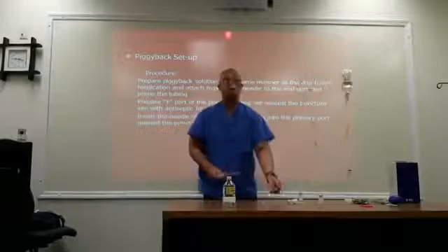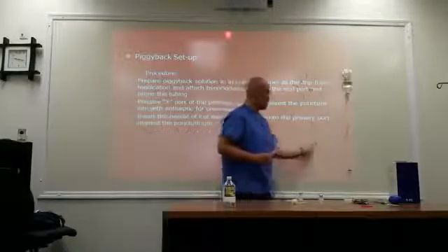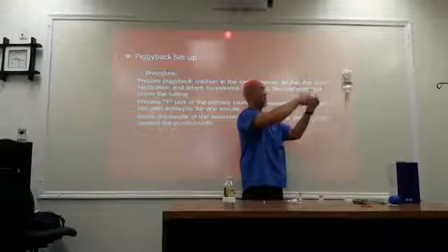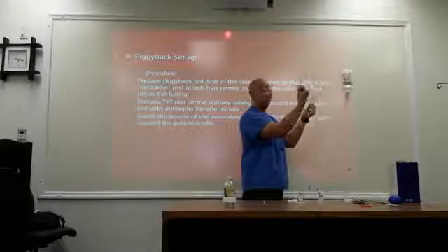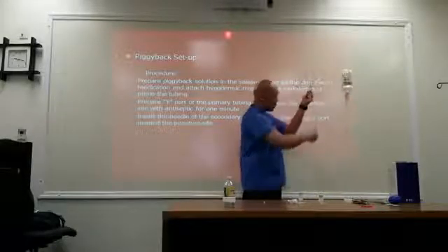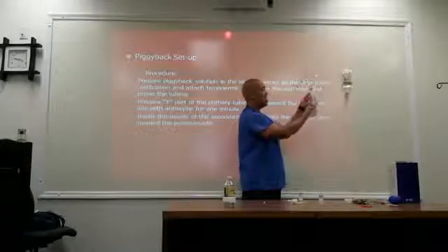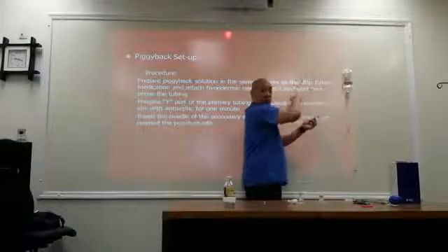Okay, so piggyback method. You guys watching? It's already existing. I'm just going to connect to one of my side ports. Okay, it also has a luer lock and a valve. I'm going to clamp off the main line because when you're injecting through, you don't want the contrast going back into the person's IV bag. So we're going to clamp the main line off so that when you inject, it's going to go straight into the patient's vein.